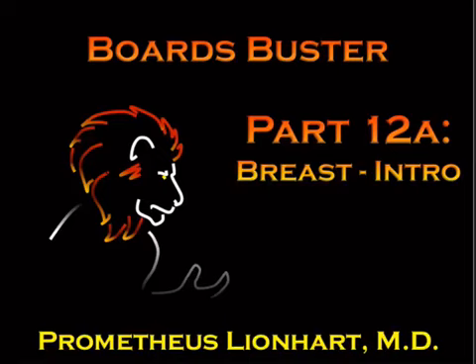So this is part one of the breast series. It's going to be a multi-part series, starting out with an introduction here. I'm just going to go over some basic vocabulary, basic localization and stuff. This lecture is mainly for people who are foreign medical graduates who have not done a lot of mammo or haven't done it here in the States.